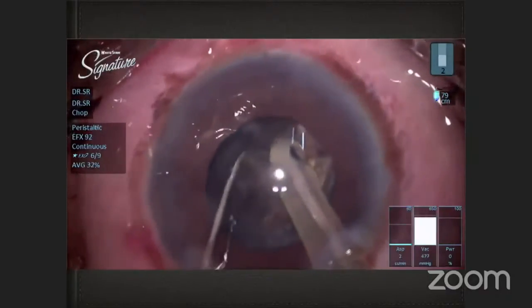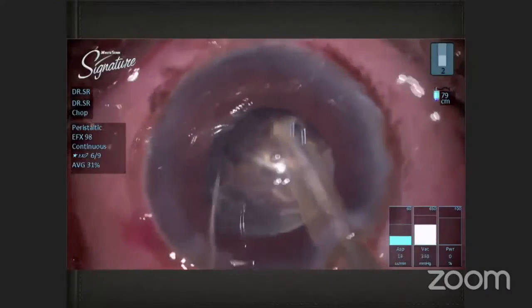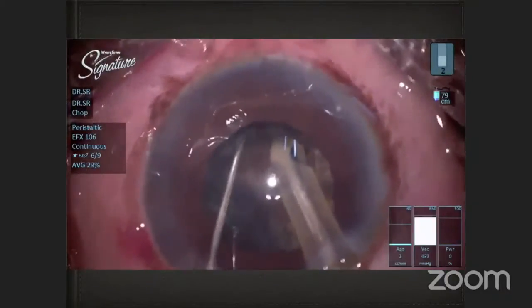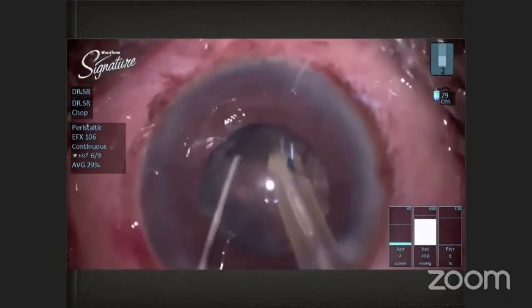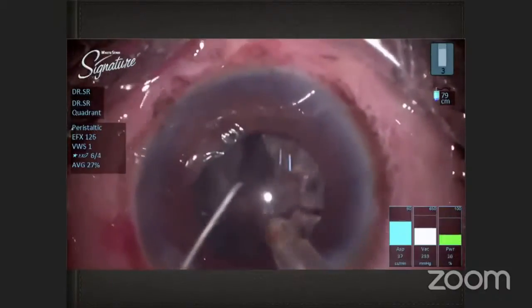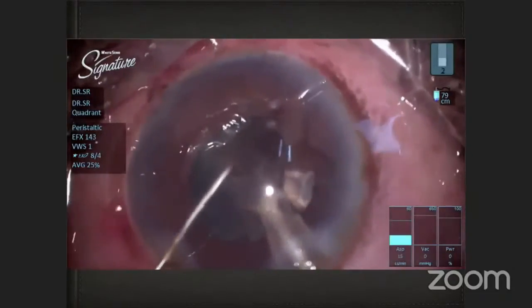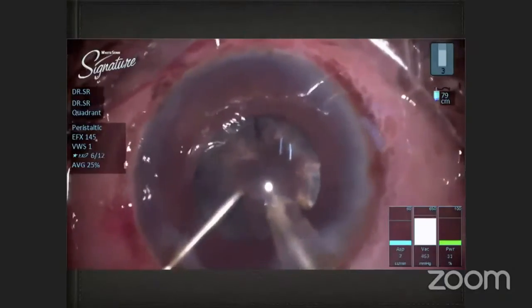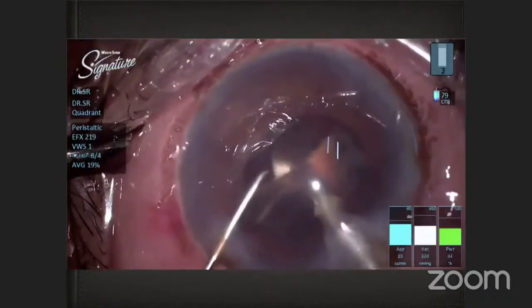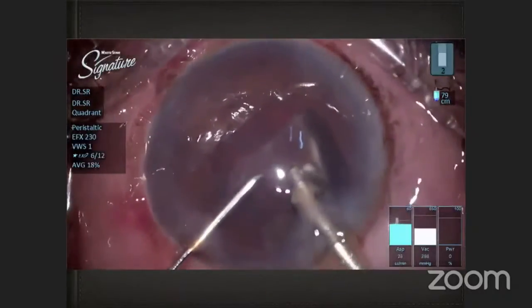So it's important that you keep separating, going deeper at a multi-level and ensuring that the last bit of fibers are also separated. It's important that you have a complete separation before you start emulsifying the pieces, because any premature emulsification or any premature attempt to remove the piece into the anterior chamber can cause excess stress on the zonules. And it's important when you start removing the first piece that you have a look at your capsular margin and ensure it's not tilting in one direction, because any excess maneuvers during your chopping procedures can cause a little bit of zonular dialysis, and you have to be exceedingly careful that it does not extend during the residual part of your phacoemulsification.